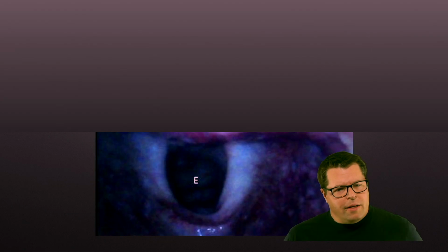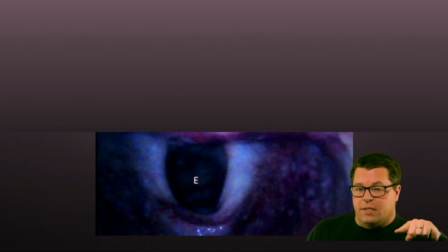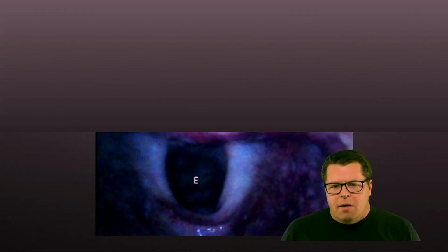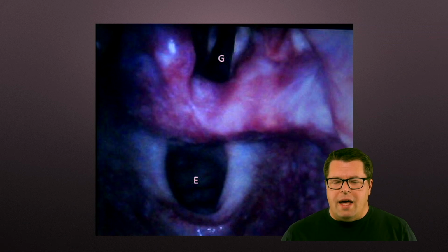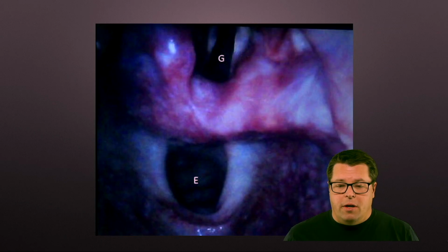You look at these cords here and think okay, great view, I got this. And you tell somebody, yes, I see that tube going through those cords. And you may even look at it afterwards and say, yes, 100%, that's got to be there. And you put End Tidal on it and you get nothing back. Or you get maybe a little spike back and then it goes away. Why? Well, because our eyes get fooled sometimes. Because if you pull up hard enough, you can make the esophagus hole look a lot like the hole in between your vocal cords. And so simply saying, I saw it go through the cords is not good enough.